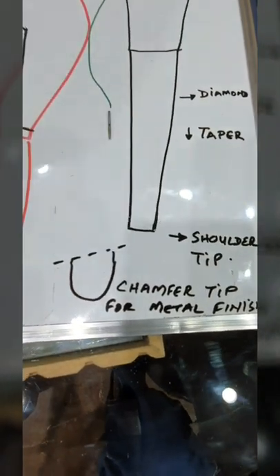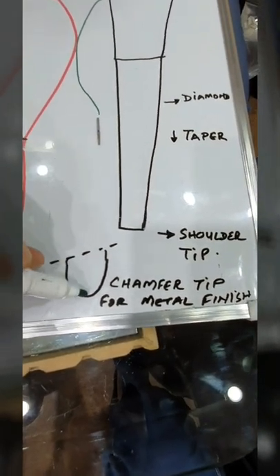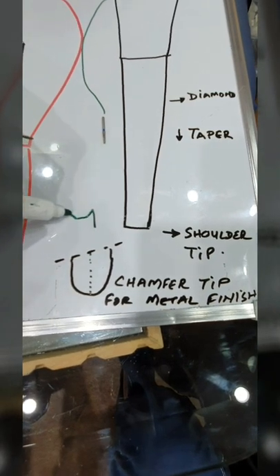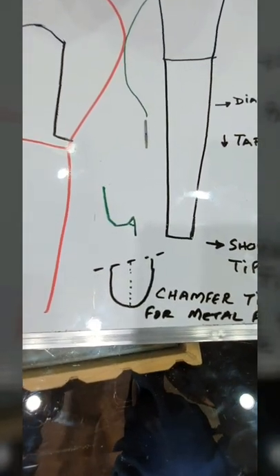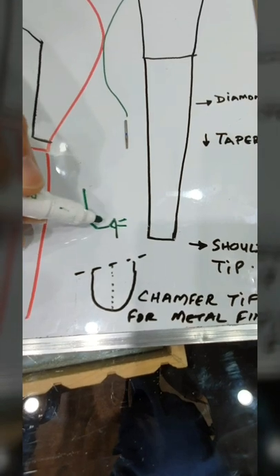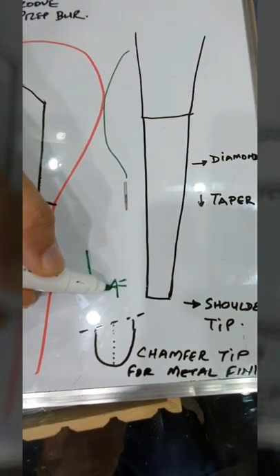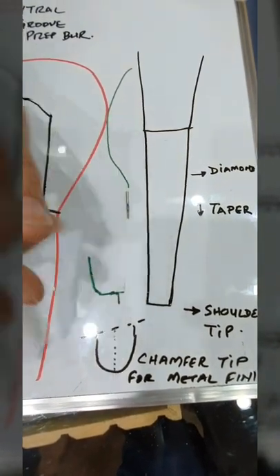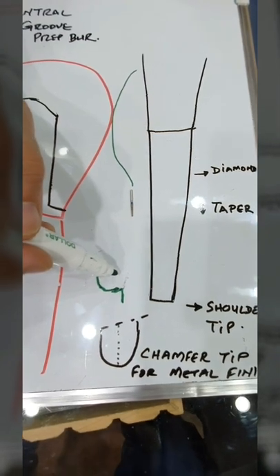The chamfer would be needed if you are doing a crown prep to finish in a metal margin or in gold. But when you are doing it with a chamfer tip, you can only use half the tip. Otherwise, what you get at the margin would be something like this, and this part would be the ski jump and not only unsupported enamel. If it is into cementum or dentin, then this hook would break off regardless, and it would prevent the seating of the crown. So if you do a nice, rounded inside margin, you can use a chamfer, but you still would need to finish the outside either with a hand instrument or with a shoulder prep burr. So take the internal rounded edge and then exit flat to ensure that you do not have any unsupported enamel or a hook at the end called a ski jump.